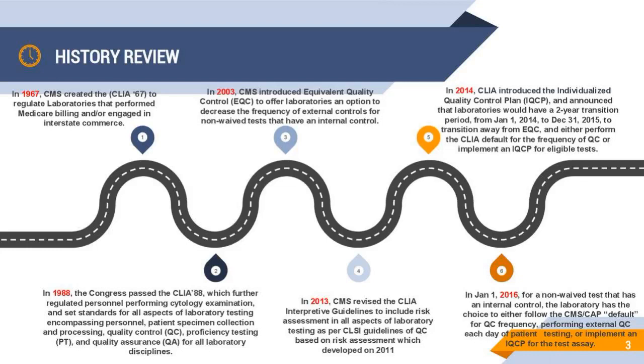In 2016, for a non-waived test that has an internal control, the lab has the choice to either follow the CMS CAP default for QC frequency, performing external QC each day of patient testing, or implement an IQCP for the test assay. So it was optional; if the lab does not follow the CAP or CLIA requirements for QC regulations, then they have to do the IQCP for non-waived testing.